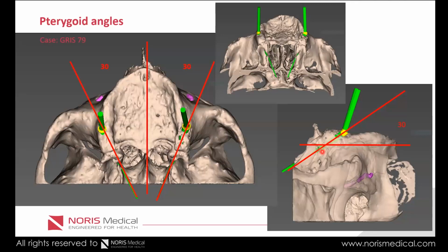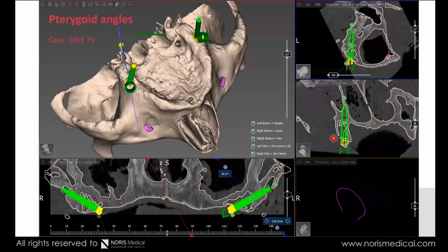But as long as we're doing that with an osteotome, we are not damaging anything. We haven't damaged the bone yet, and we can still correct and enter at a different position. We push and hit the osteotome to make an entering point into the cortical bone.